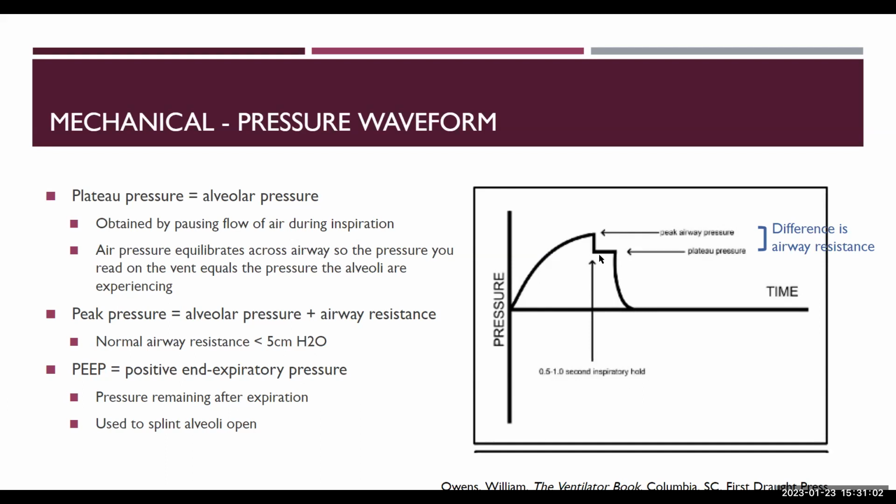And these two values, I would say, the plateau pressure and the peak pressure, are big ones that you keep in mind to see if anything's going on or any issues. And we're going to elaborate more about this in the talk.